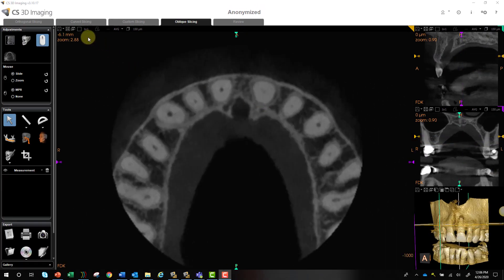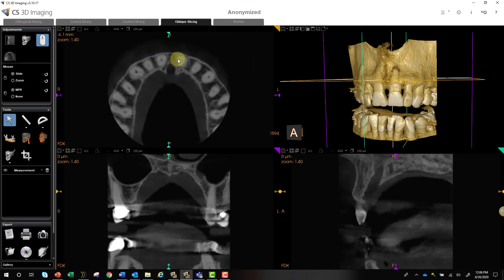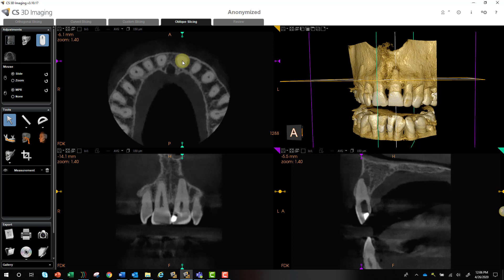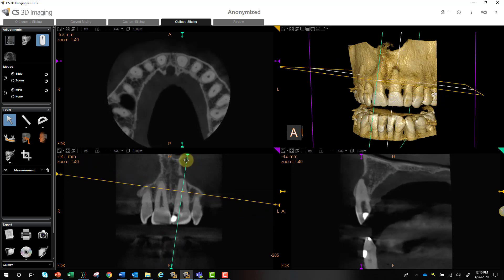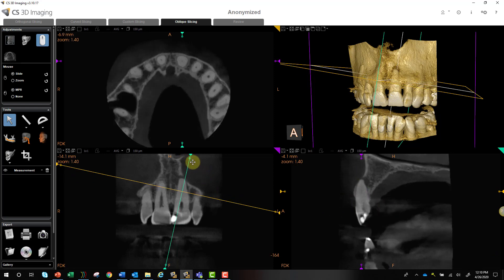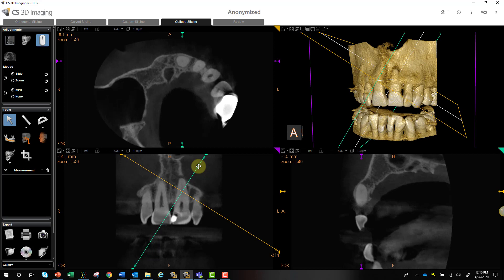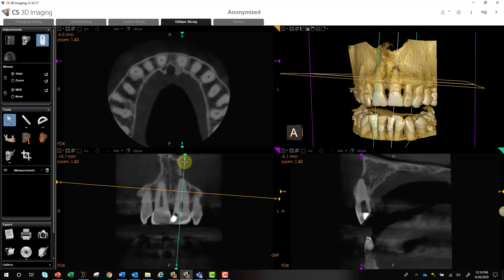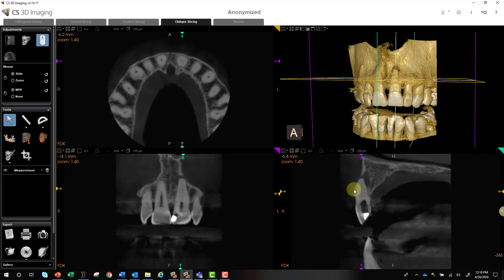So what next? Let's use my mouse wheel as a button — I'm going to push down on the button to center all of my views on the area that I'm pointing to, like that. Now make sure your slices are aligned to the long axis. We can see over here this is already aligned nicely, but if it were turned — if you focus on my right-hand sagittal view — we don't want our slice looking like this. We can move it to the long axis, and now we can see things much, much better.